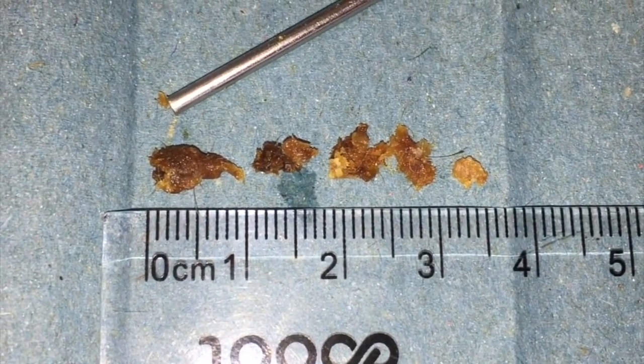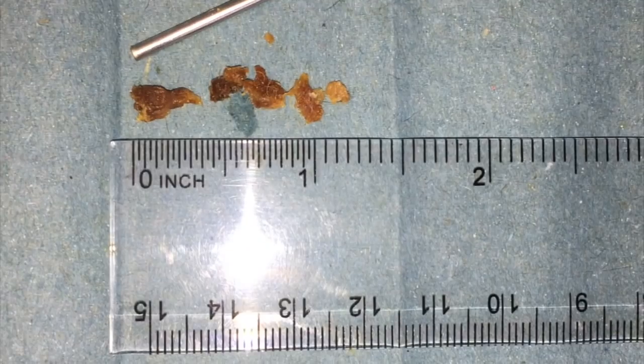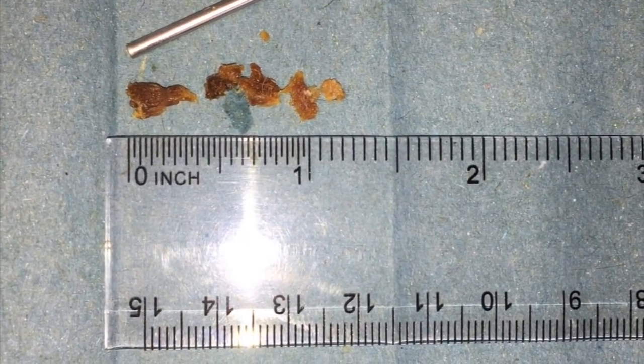So this is what we removed from both sides — lots of little smaller pieces compared to what we normally get out.